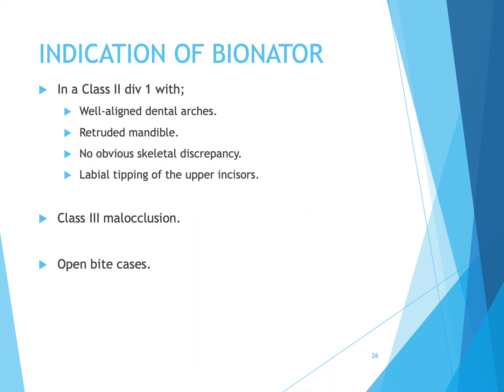Indications of the Bionator: the Bionator is used in Class 2 Division 1 cases with well-aligned dental arches, retruded mandible, no obvious skeletal discrepancy and labial tipping of the upper incisors. The Bionator can also be used in Class 3 malocclusion and open bite cases.